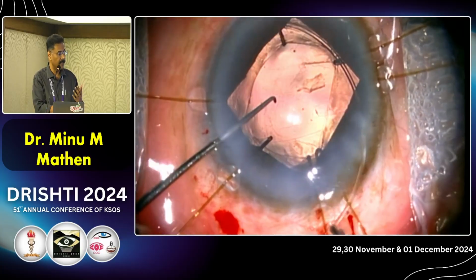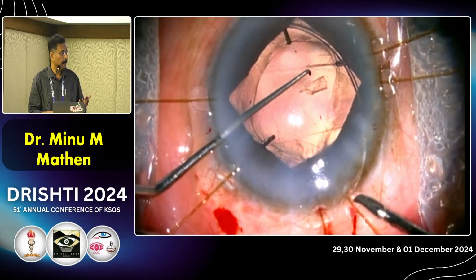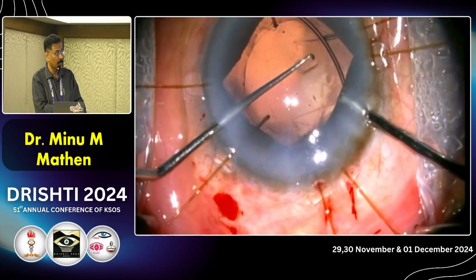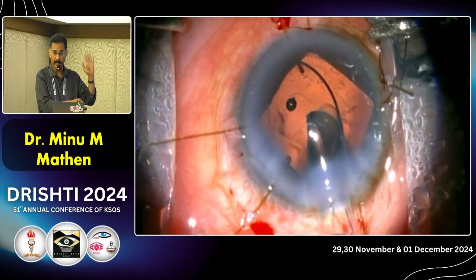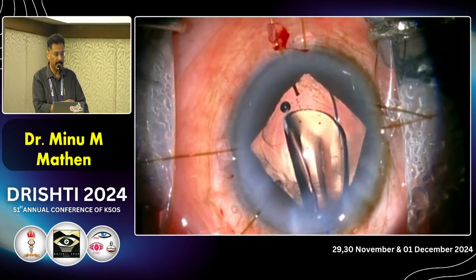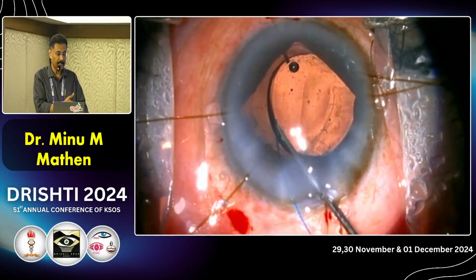After this, the CTR goes inside, the hooks are taken off now, and then this is the technique which I always follow. So you hold it and go close to it, use the second instrument, direct it and leave it. So then the iris hooks are released, and then place the 3-piece IOL into the sulcus, and once it is in the sulcus, you visualize.